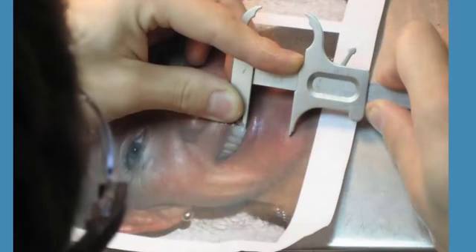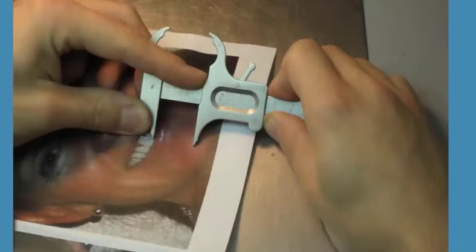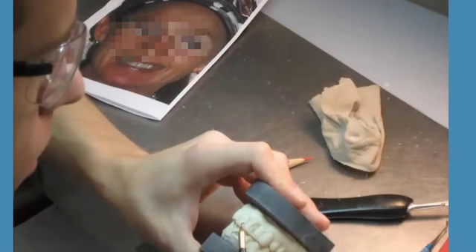In our laboratory, we do a smile simulation, and then we actually measure the before photo. And then we measure the same tooth as an after. We're able to come up with ratios to determine that tooth number 8 has been lengthened in the imaging by 1 millimeter.